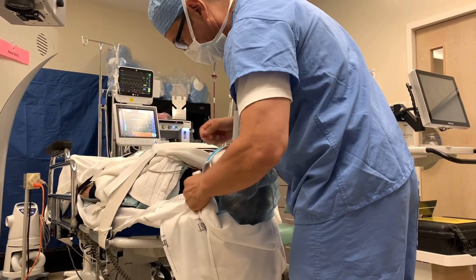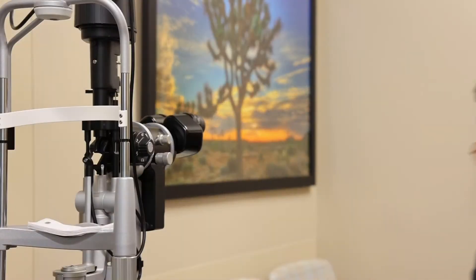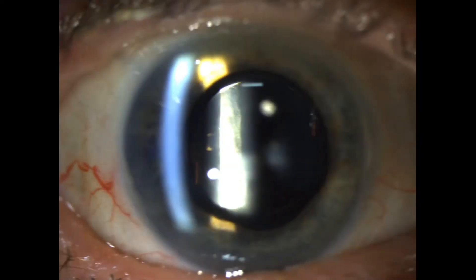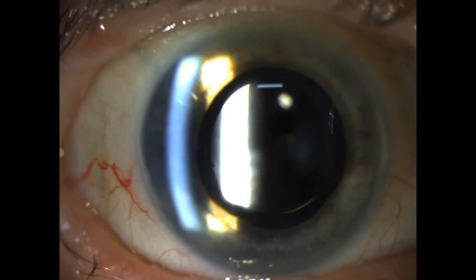When the surgery is done, we place a patch over the eye and the patient is brought to the recovery unit. So how did this patient do? Let's have a look at the slit lamp to show you the results. Right away, you can see the lens implant is perfectly centered with a dilated pupil.